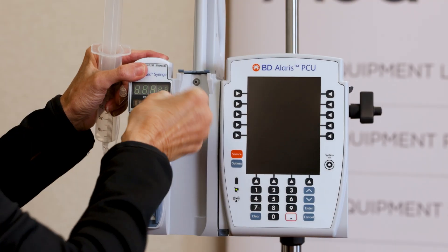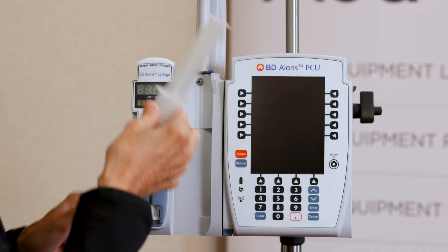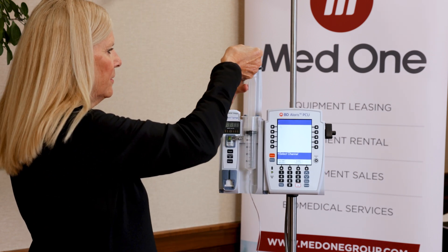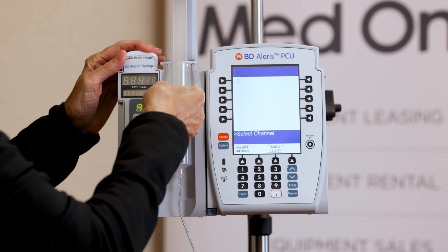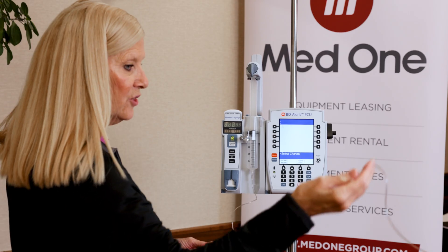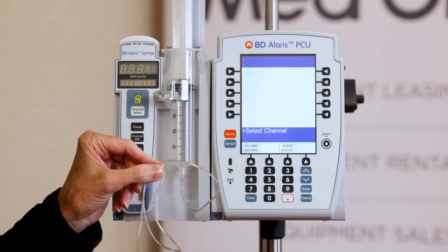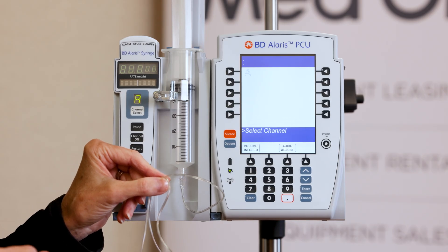I'm going to raise the driver head up, pull the barrel clamp out, take my syringe and load it up underneath the little gray shelf. Then I will lower the driver so it grabs the top of the syringe plunger, rotate the barrel around, and now we're ready to program the infusion. I have a straight extension set attached — you can use whatever extension set you need. You will manually prime your extension set; I've already done that. This extension set has a priming volume of 0.7 ml.